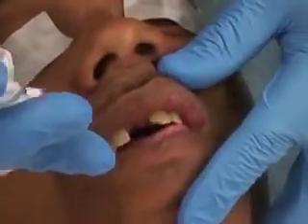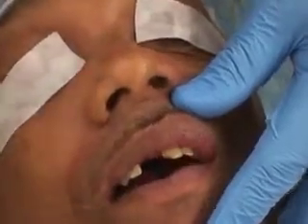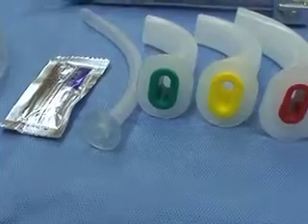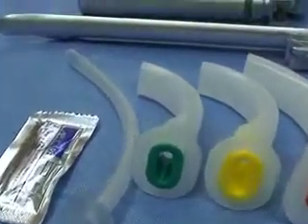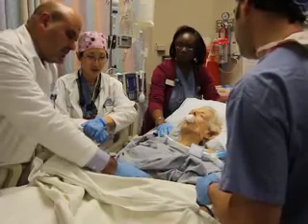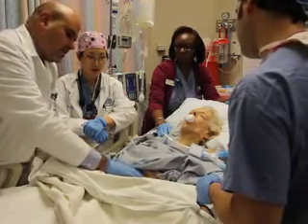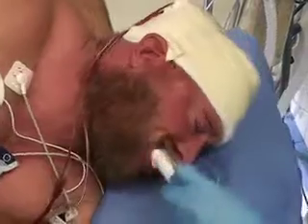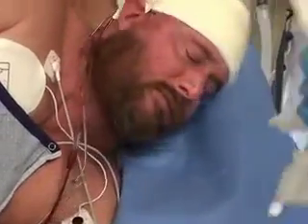Endotracheal extubation should be performed without causing trauma, while maintaining adequate oxygenation and ventilation. Appropriate equipment for suction, ventilation, and reintubation should be available. If extubation is judged to be unsafe, the procedure should be postponed and the patient should be reevaluated. Most complications related to extubation are preventable.